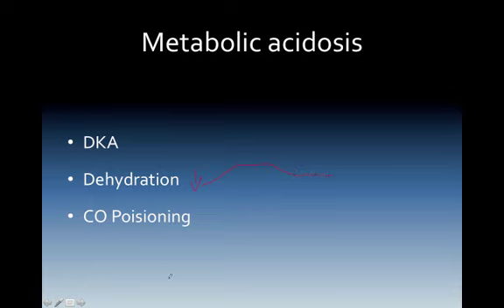In CO poisoning, if we're over 5% of CO poisoning, so a person has got dosed from a good CO open flame source, if it's over 5%, it could interfere with the amount that we see. So what this would cause us to see is low end-tidal CO2 initially, and the reason for that is because the hemoglobin molecule is locked up with the CO. It can't exchange the gas as well at the cellular level.